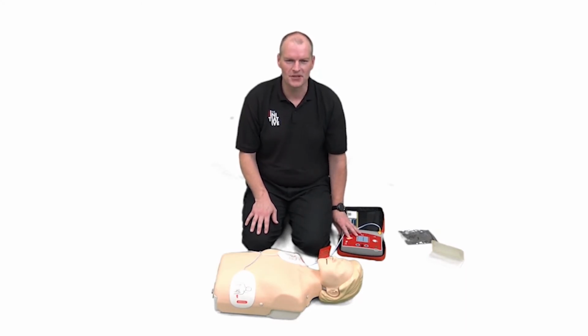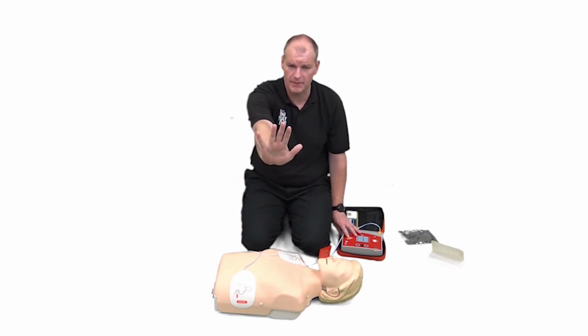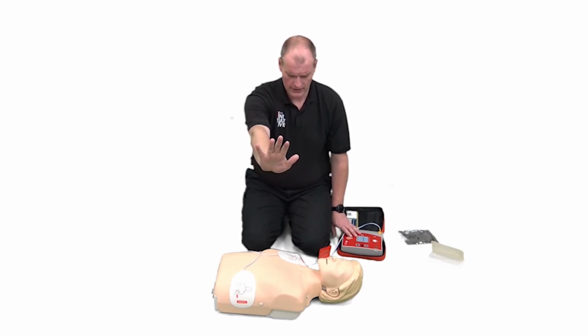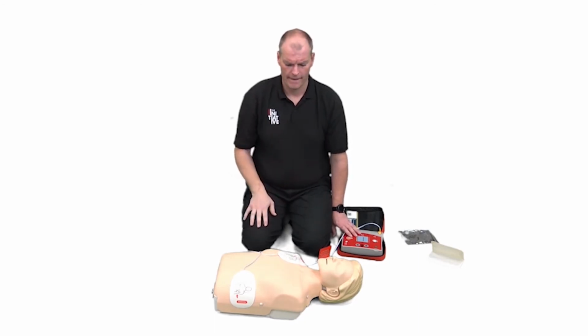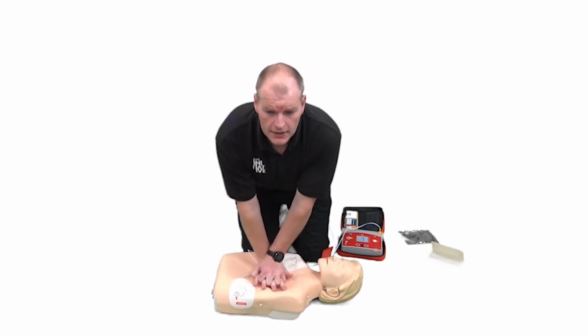At this point, make sure that nobody else is touching the casualty as you deliver the shock. So eyes up, hands up, everybody clear. Shock delivered. Pause. Start CPR. Then we're going to go straight into doing our chest compressions.